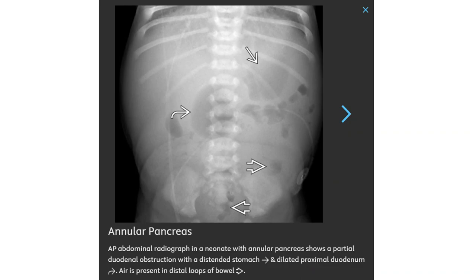AP abdominal radiograph in a neonate with annular pancreas shows partial duodenal obstruction with a distended stomach and dilated proximal duodenum, with gas present in the distal loops of bowel.